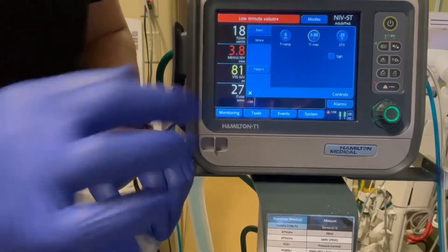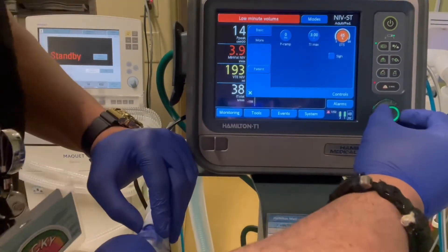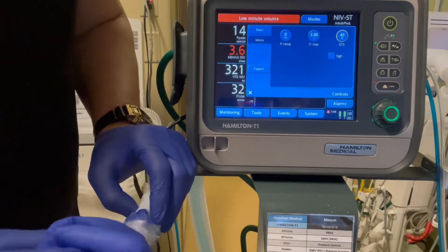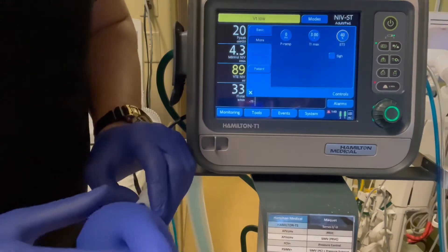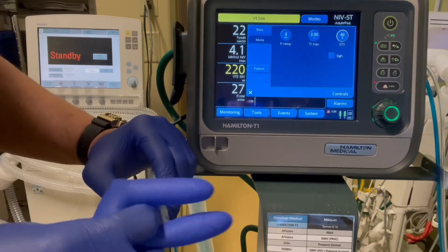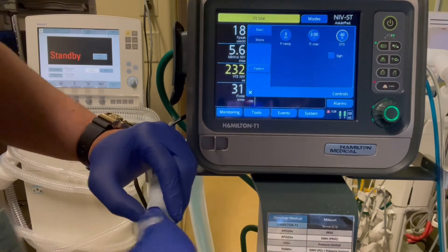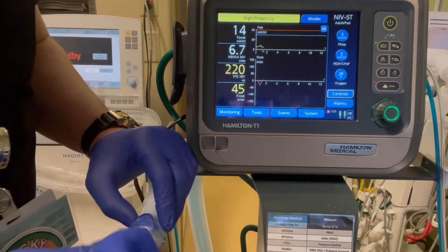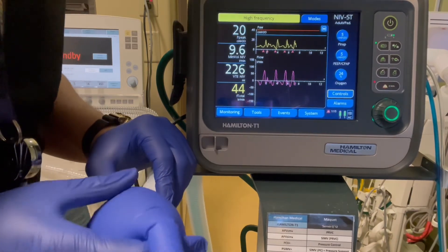The next thing we're going to set is the expiratory trigger sensitivity. We're going to take it from the default 35% and make it a little bit higher — we're going to go to 40%. What that does is ensure that we cycle the breath from inhalation to exhalation at a higher percentage of the peak inspiratory flow. If there's a leak, it's going to act as a kind of leak compensation, ensuring our patient is more comfortable, delivering the volumes we give them, with a little less beeping. We're going to get better patient compliance hopefully with this.